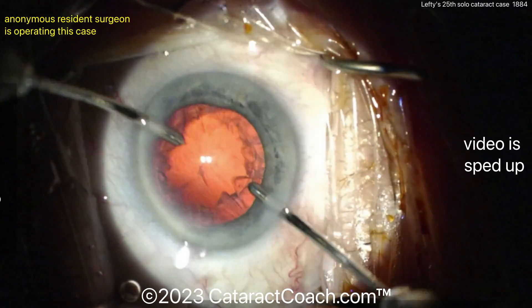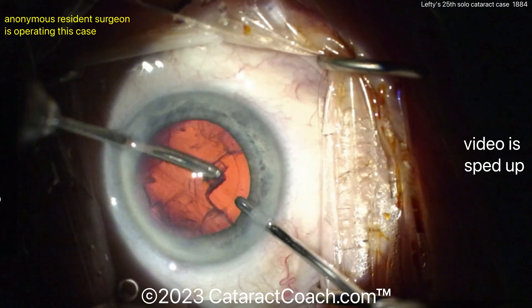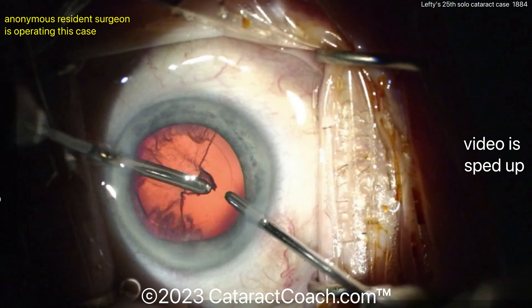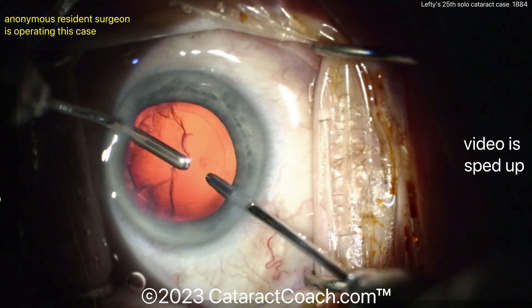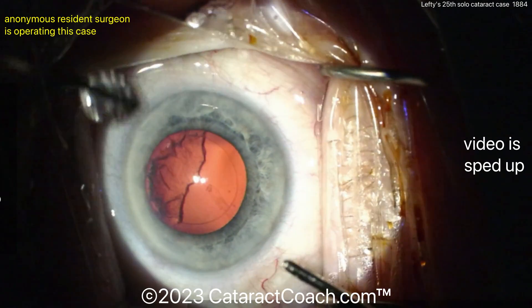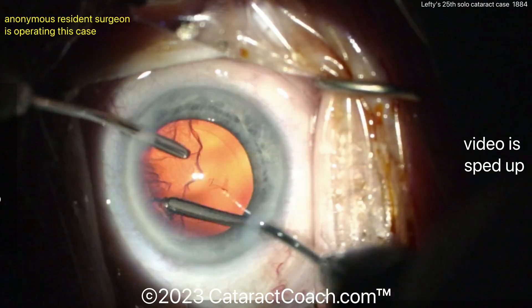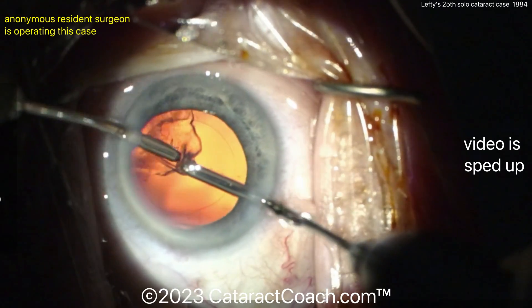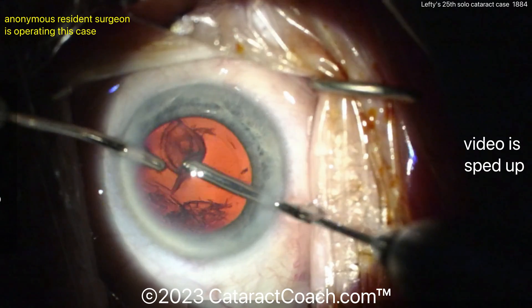By manual irrigation-aspiration to get that cortex out — that's always a nice technique. Bimanual really gives you a lot of great access 360 degrees. It does require an extra incision and a little bit different instrumentation, but it does make life easier, especially when you're learning these cases. You can switch hands now — so half the cortex removed. Now at this point, the irrigator in the left hand, the aspirator in the right. Even this left-handed surgeon, you're able to use both hands together. That's why I say it doesn't really matter if you're right-handed or left-handed — you're going to use both hands together in cataract surgery.